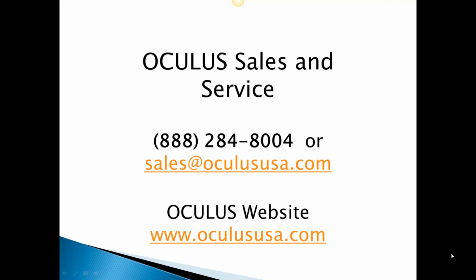So the educational value that I've received from analyzing all of these CSP data maps that I've been collecting over the last year and a half or so has really pounded into my head that regardless of what's going on the cornea, it has nothing to do with what's going on the sclera, and you really have to treat the sclera as a separate entity.